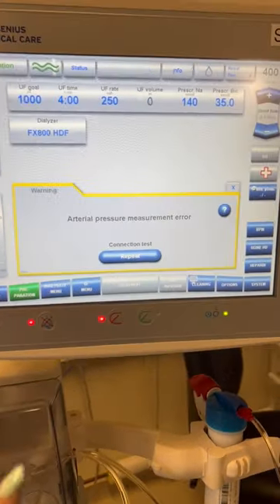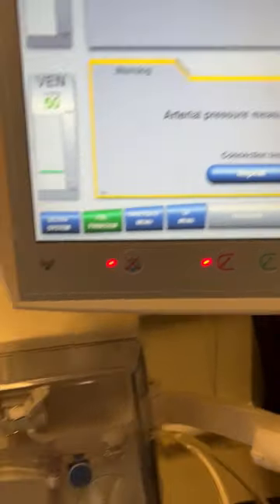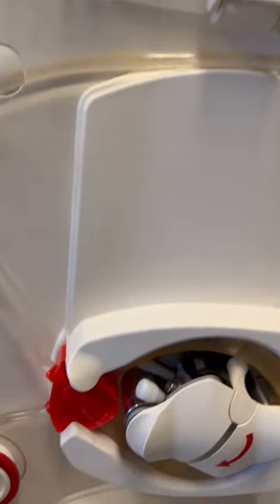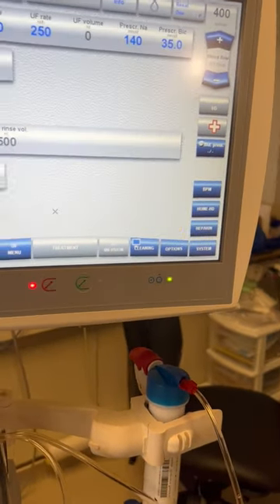The alarm has come back up again. Checking the heparin syringe — it looks like our syringe is inserted correctly. So we'll just repeat the connection test once more.